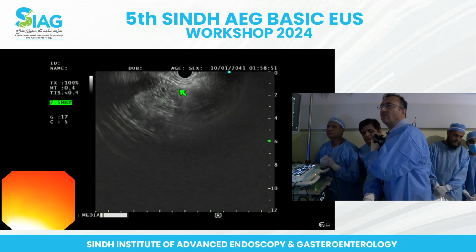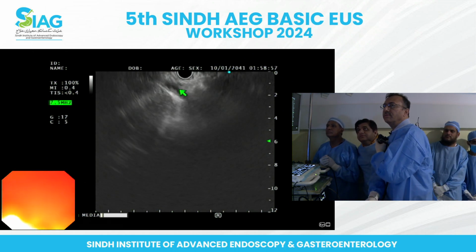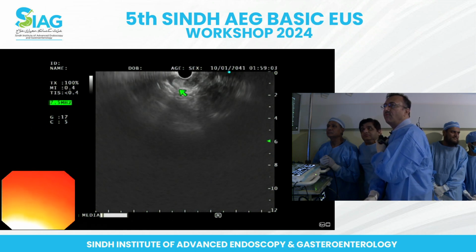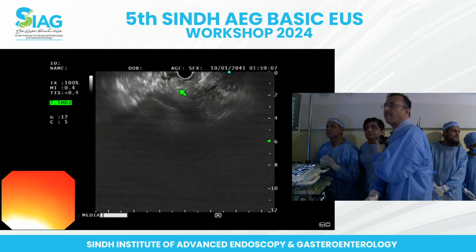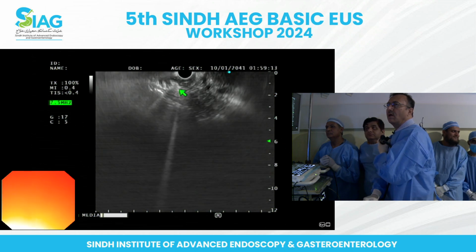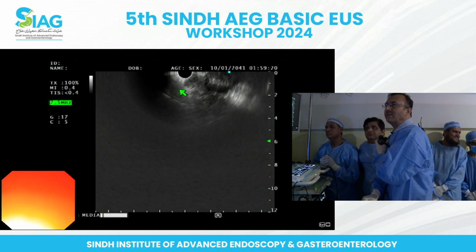So we return right now. Clockwise. Clockwise, right? You see your kidney came. So slight pull further, and we can see that we are already at the pancreas. And we see that there we have the two parallel lines of the stent.